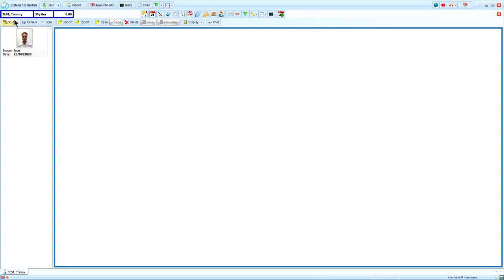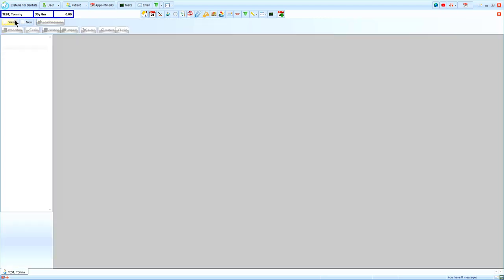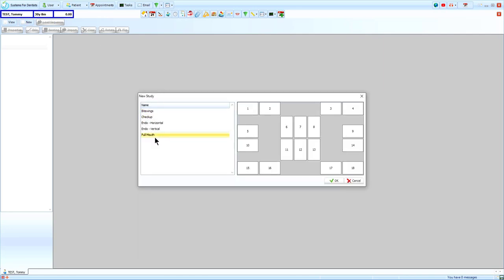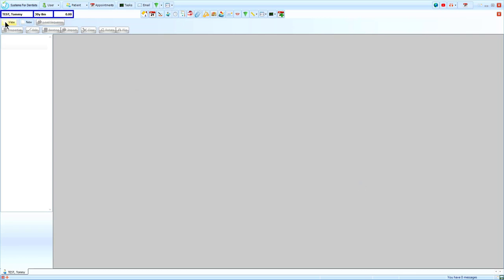The first is study. This allows you to add images to a template for further study. For example, bitewings, checkup, and a full mouth. These are customizable and can be created to suit your specific needs.